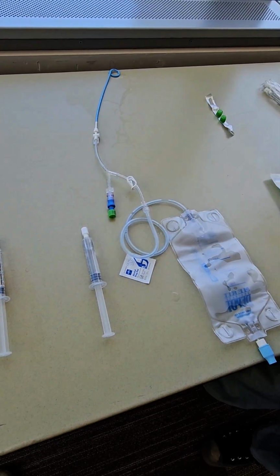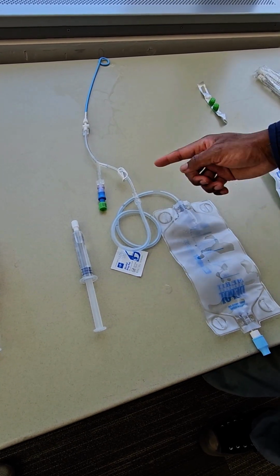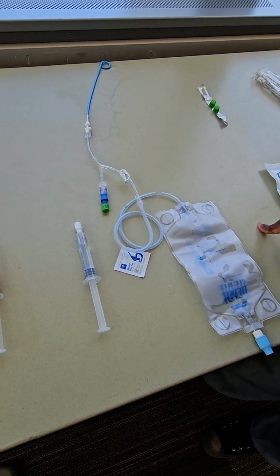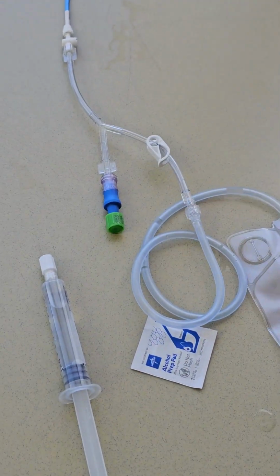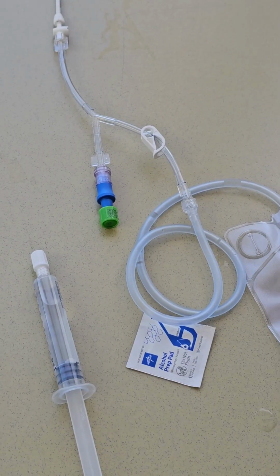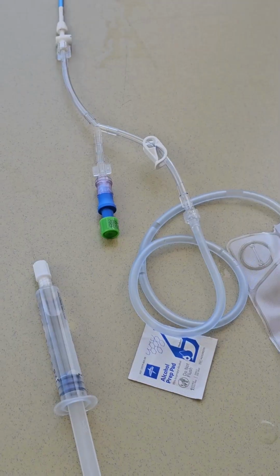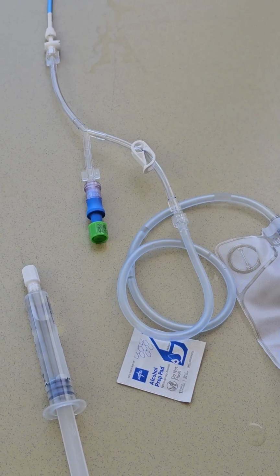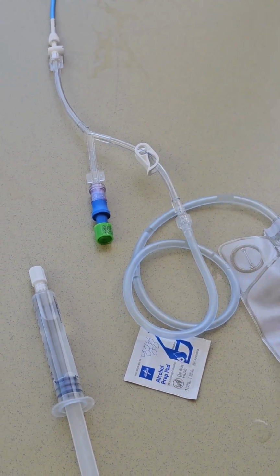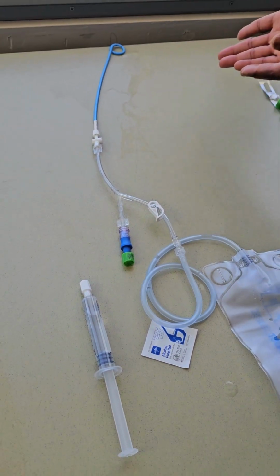So some of the things to first look out for when you're troubleshooting these is to look and see whether the clamp is open if a patient says that they're not draining appropriately. One of the things to look at when a patient comes in, for example, complaining of leakage, is these connections and making sure that they are tight. Another issue that may occur is potentially the drain being clamped after the patient has flushed it. And if they're not draining, it's possible that the clamp is closed.